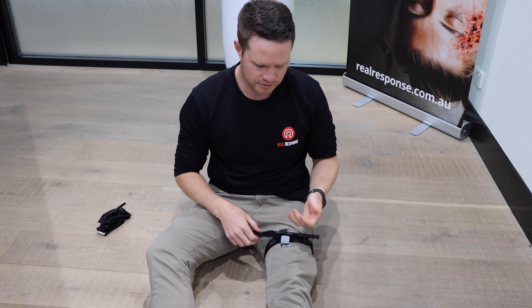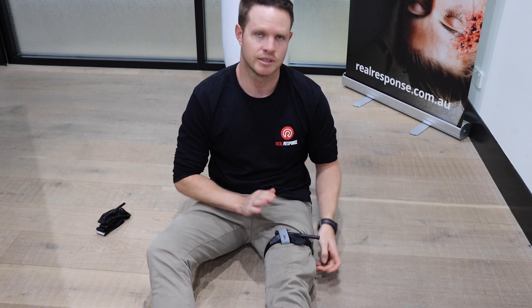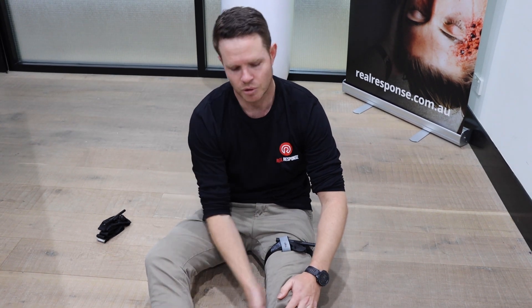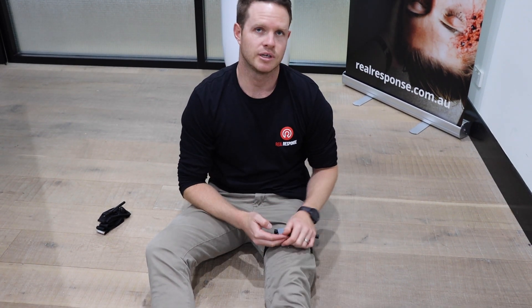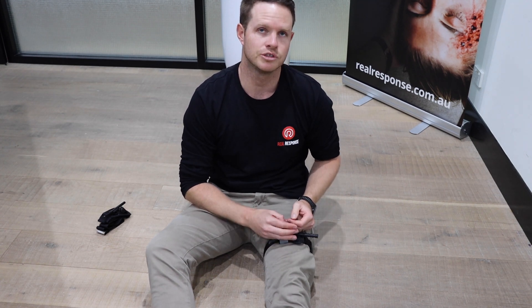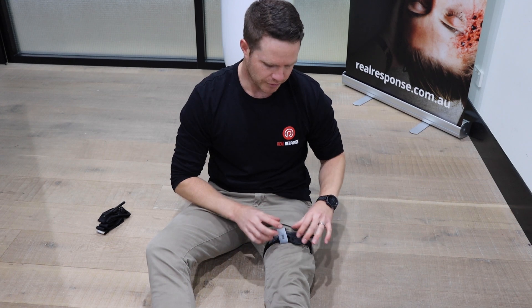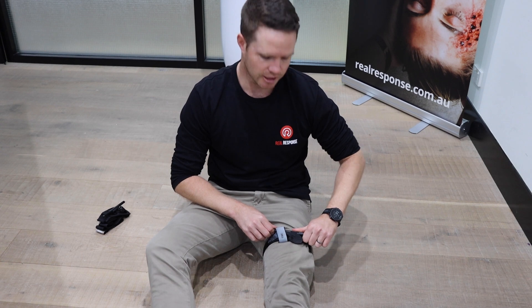Feed the rest through, lock everything in place, and write the time - making sure bleeding has stopped. You can then feel for pulses moving down that leg, behind the knee or on the foot. If you need to put another tourniquet on, go as close as possible to the last one, offsetting the windlass so they don't get caught with each other.